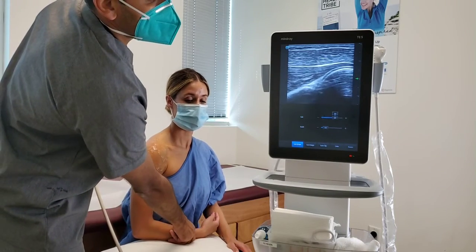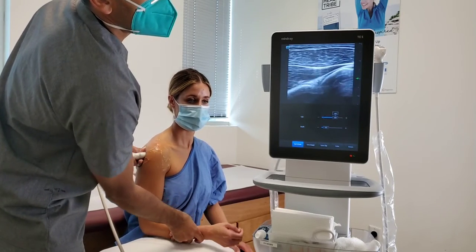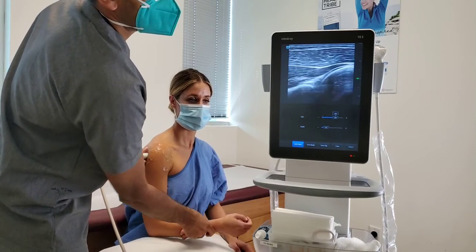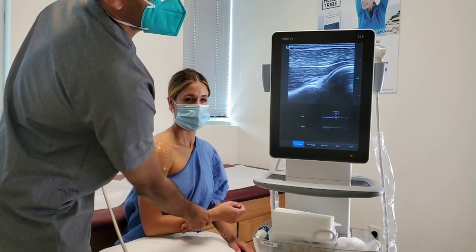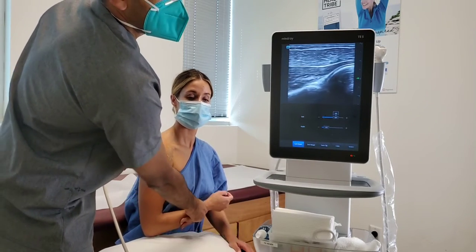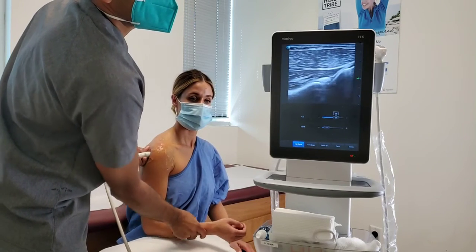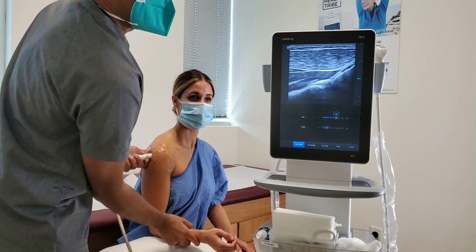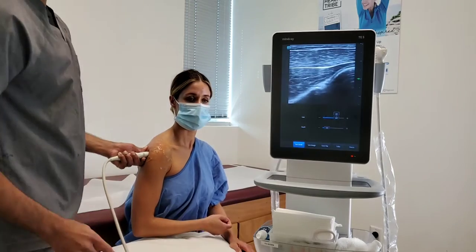And what we're going to do is we're going to see how that ball and socket actually turns. As we rotate here, we could see that ball rotating on its tee, that golf ball rotating on its tee. And by doing this, we can analyze, is there any inflammation inside the joint? Is there an issue with the labrum? Is there some instability there? Has the patient had a history of a dislocation? We could see some things like dents in the golf ball or dents in the tee. A lot of stuff that we can look at dynamically from this regard.